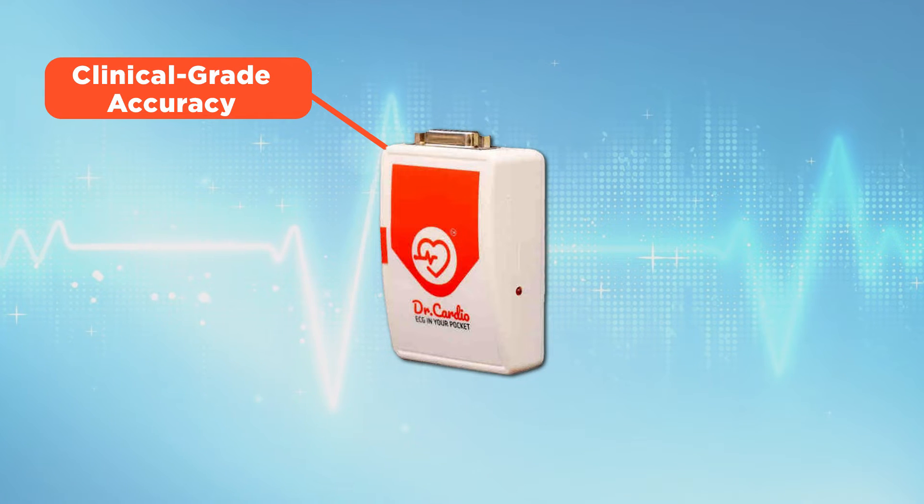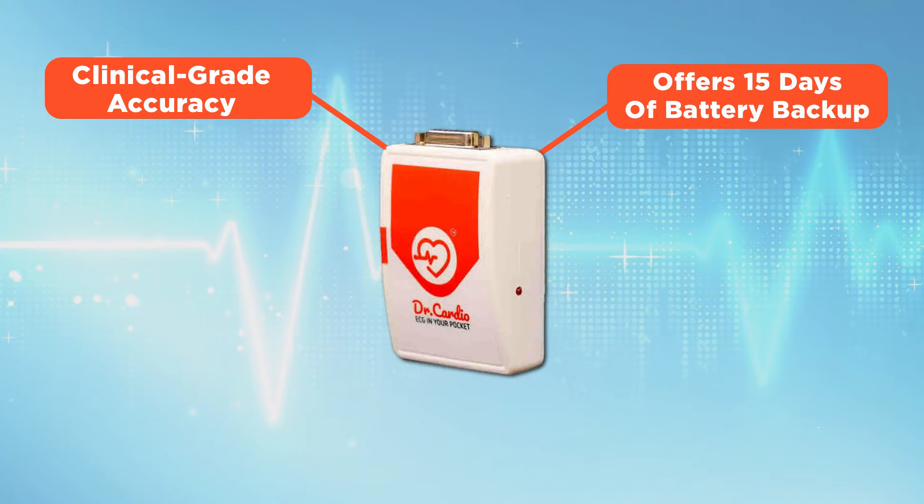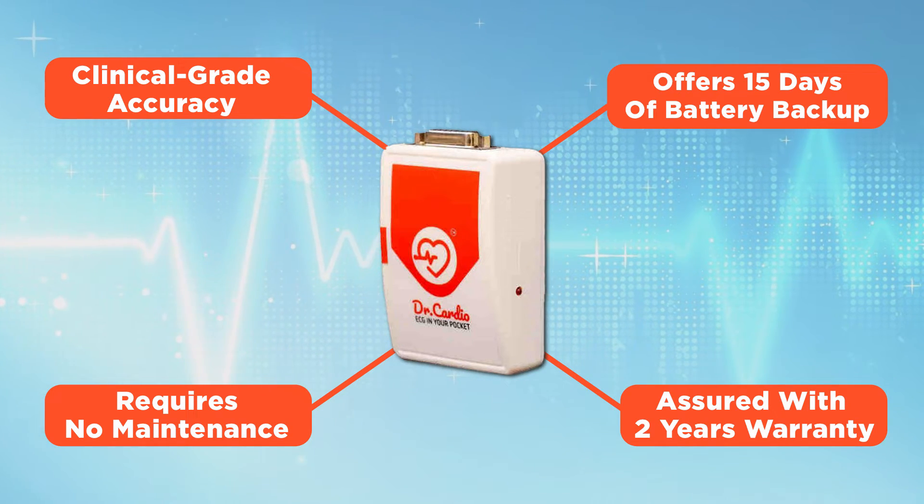This device provides clinical-grade accuracy, offers 15 days of battery backup, requires no maintenance, and is assured with a 2-year warranty.